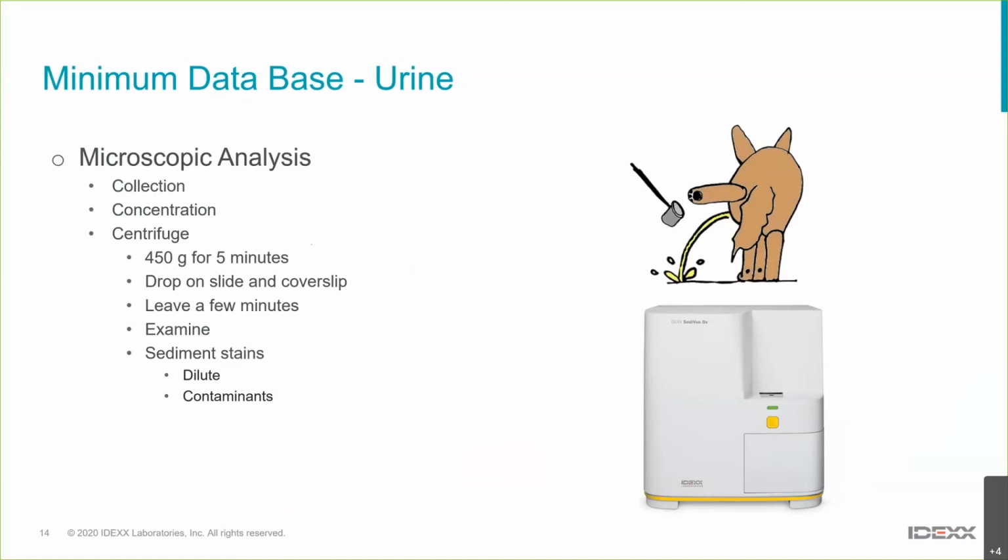Obviously, now there's the alternative of some automated urine sediment analyzers that make things a lot simpler, because they're more likely to process fresh urine. It prepares it and examines it the same way every time, so they can certainly have their advantages.